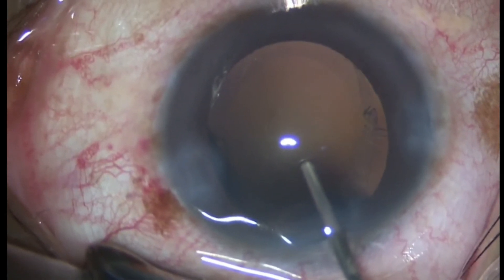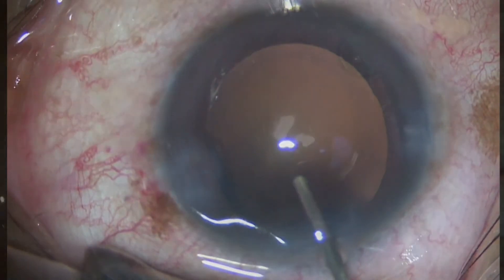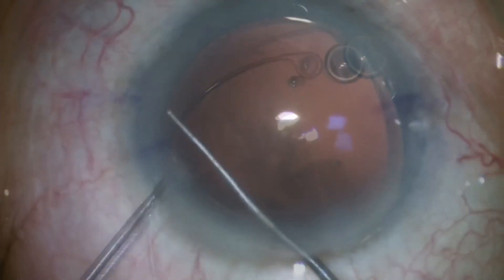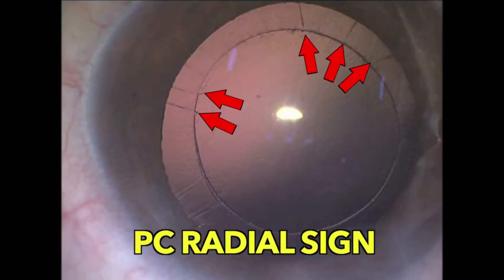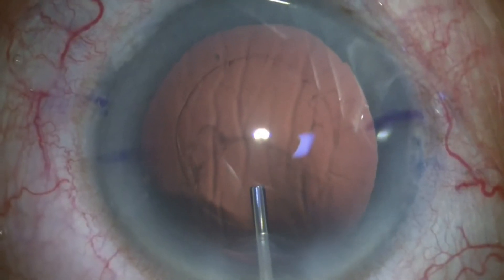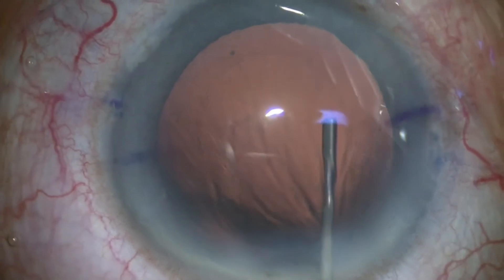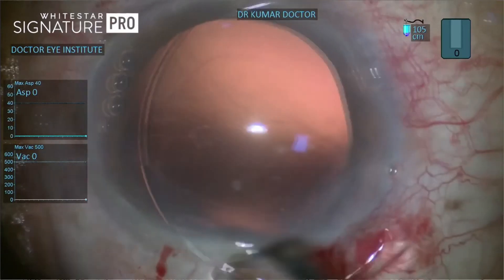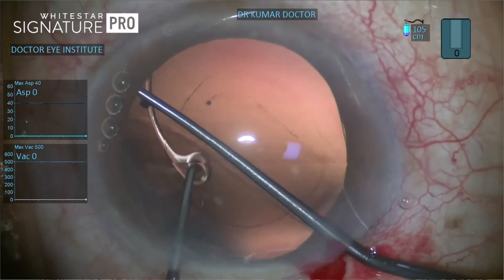We further postulate that when such bags are re-inflated with an OVD, the PC radial sign disappears. Such bags should always be strengthened by placing an endocapsular ring for better stability for premium IOLs. If you encounter it, please do not fear — gently inflate the bag with an OVD. Stabilize the PC, dropping the anchor, by placing in the bag a sturdy CTR.